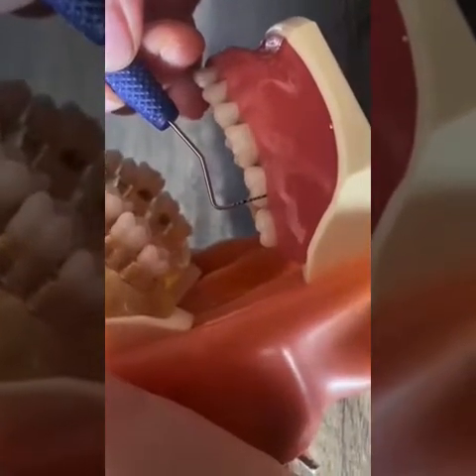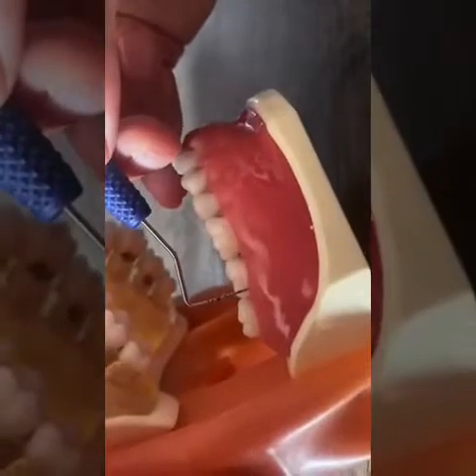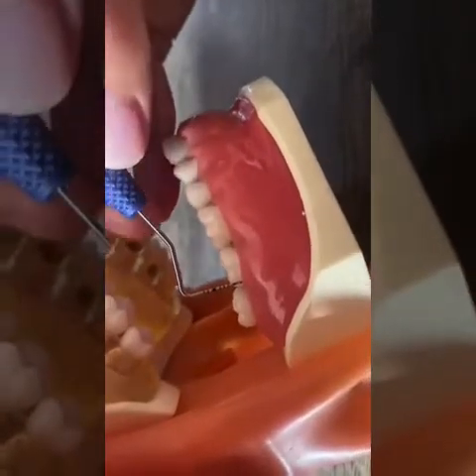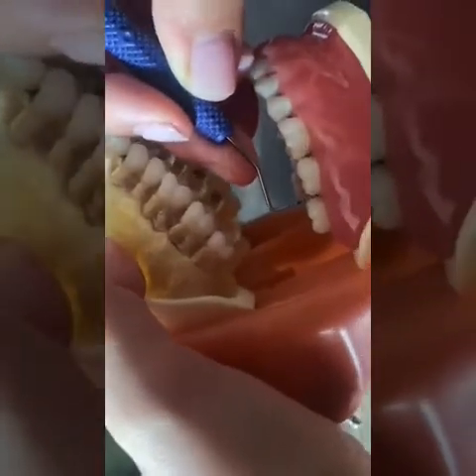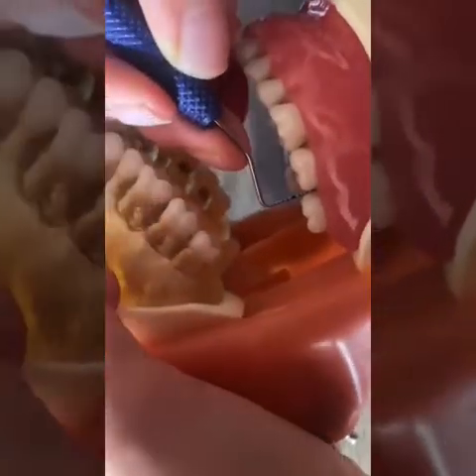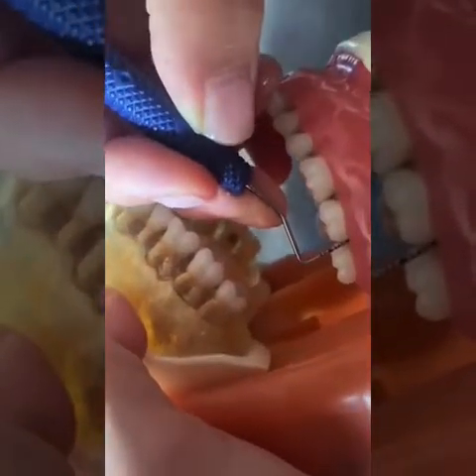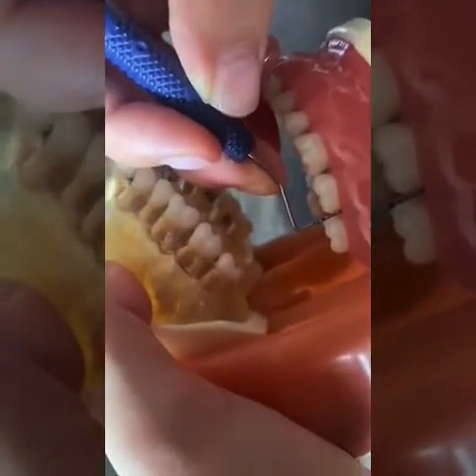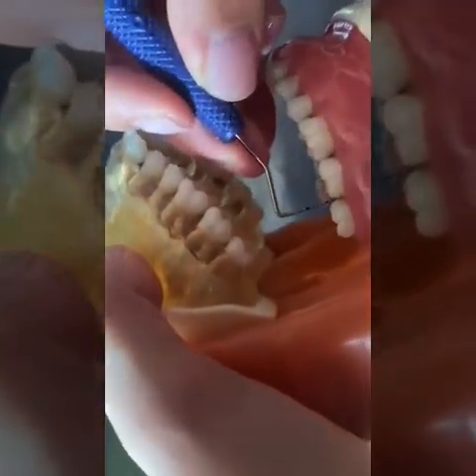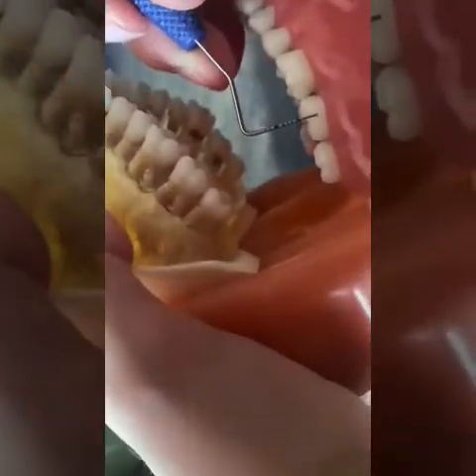We walk the probe distally into the interproximal area until we meet the contact. So we start right here, making sure it's parallel. We walk the probe, making sure we have the C shape and the fulcrum. We walk the probe all the way into the interproximal area, the col space. And once we get into the col space, we tilt the working end of the instrument 10 to 15 degrees into the col space, just like that. We end here. That's our first number, our first measurement of the tooth. Once you're done there, you take out the instrument, and that's the only time you can take the instrument out of the gingiva.